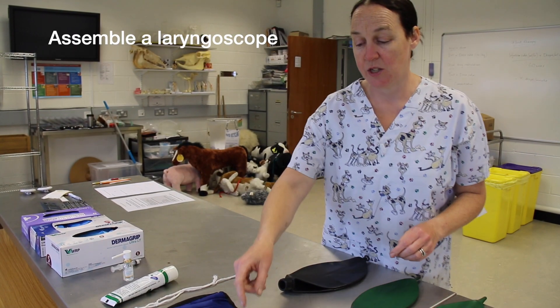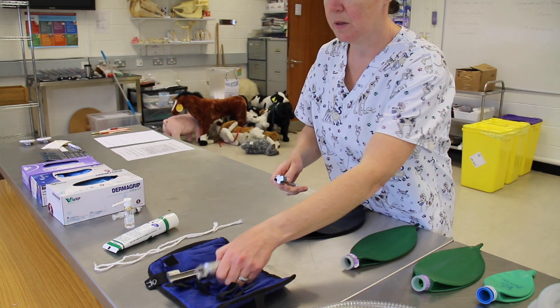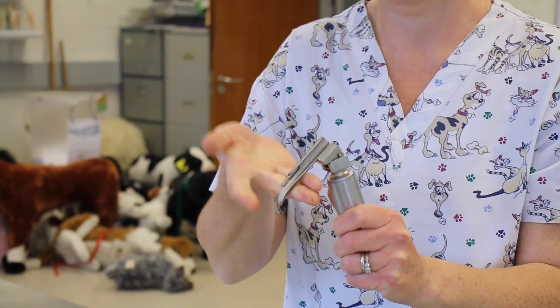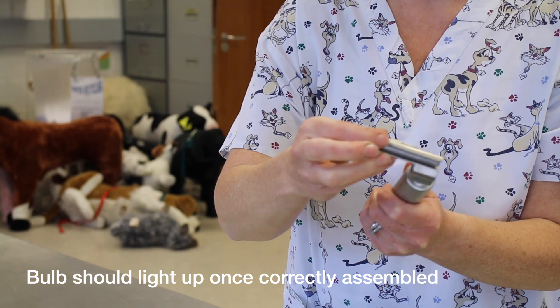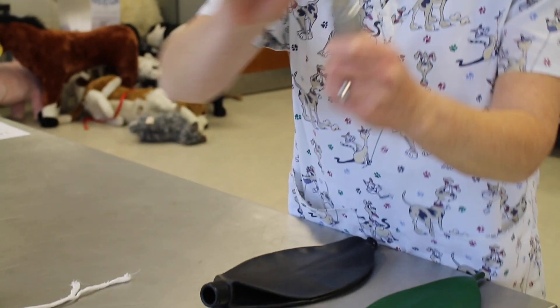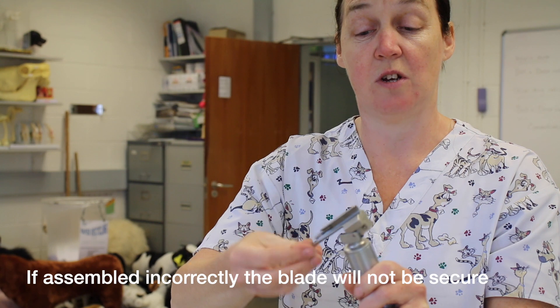The first thing we're going to do is attach a blade to our laryngoscope. You hold it at an angle, click it on, and then push it up to make sure your bulb is working. Make sure that it sits flush in the head, because you can put it on the wrong way and it's not very secure and the bulb won't work. Confirm your bulb works.